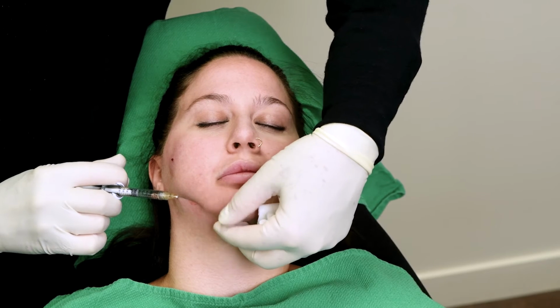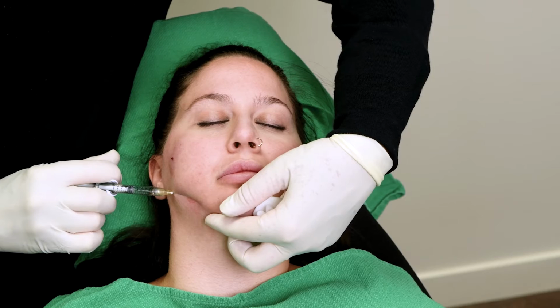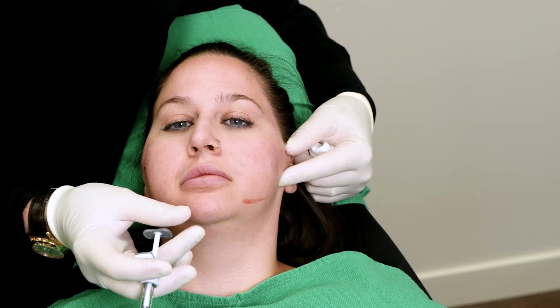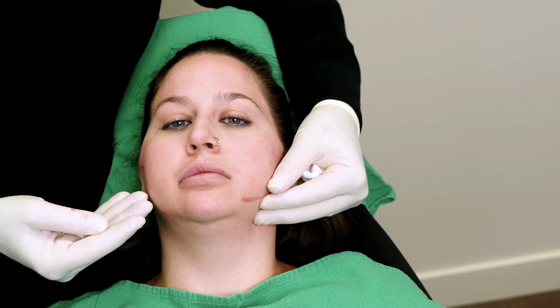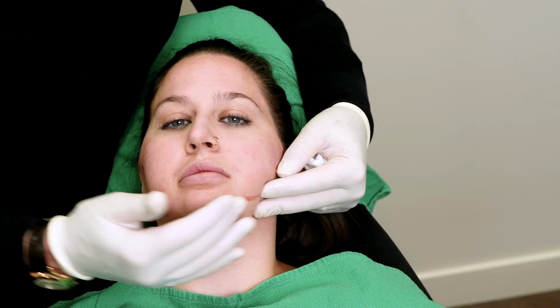And so we're just running the product in, and you will be able to see immediately that there is a change. So I'm just going to rotate her so we can see the difference one side to the other. Can you see that? As we've re-draped the jawline, how there's an indentation here, that the jawline is straighter here than it is on this side. It's more indented. We'll work to correct that change on the other side.